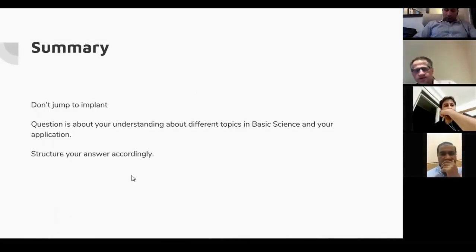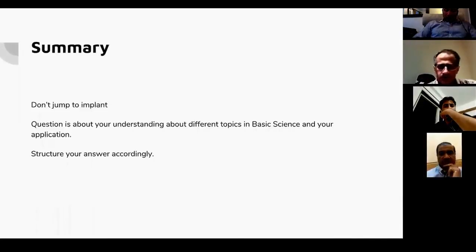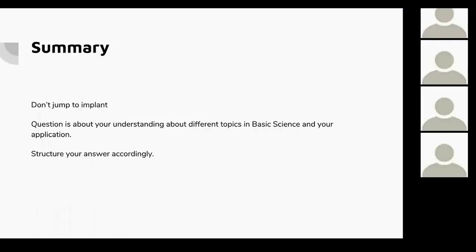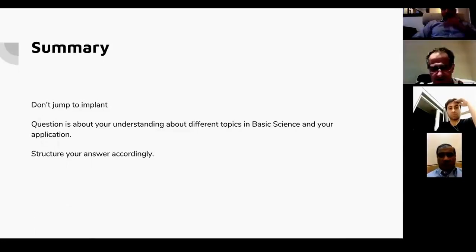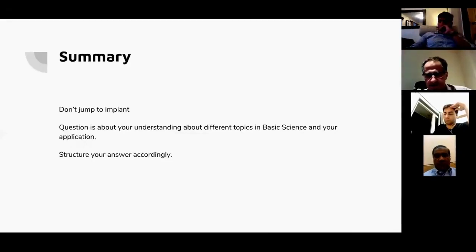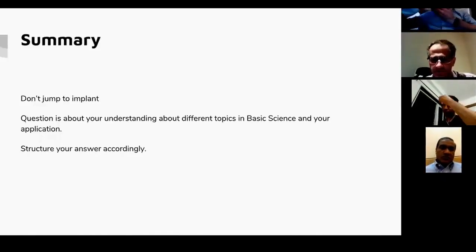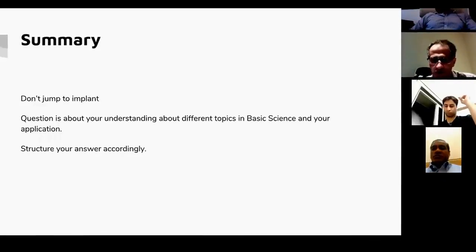Okay, so in summary, I would like to say, don't jump on implants. Don't mention names of prostheses. Don't talk about different types of names. Don't bring up companies. The question is not about what implants you know, it's about your understanding of the different topics within basic science. You need to understand the management principles of your fracture, what you're trying to achieve with your fracture and what your plate is going to do to help you achieve that, and then design your plate accordingly, okay?